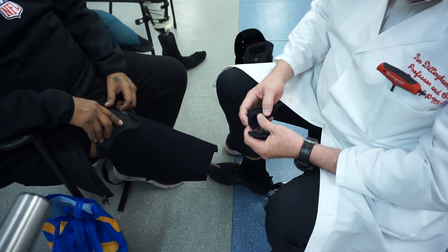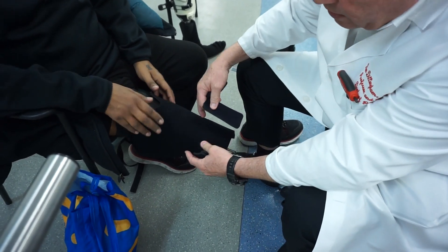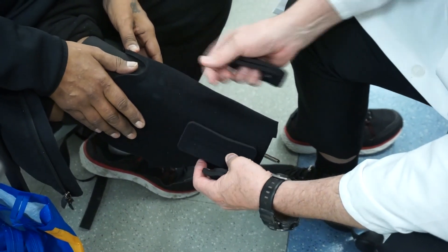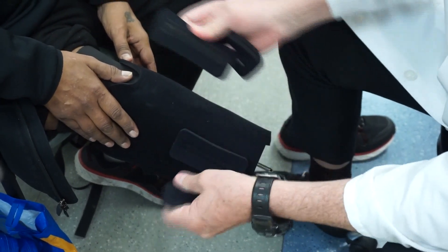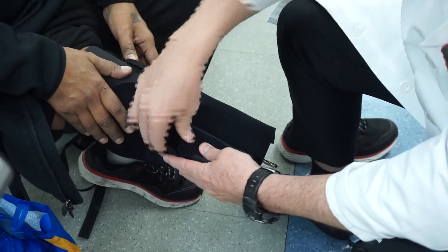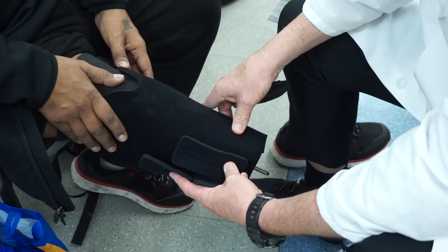The way to pad around that is to relieve that area. You do almost a donut method — you pad one side and then you pad the opposite side so that he will have padding that will prevent pressure on that particular area.